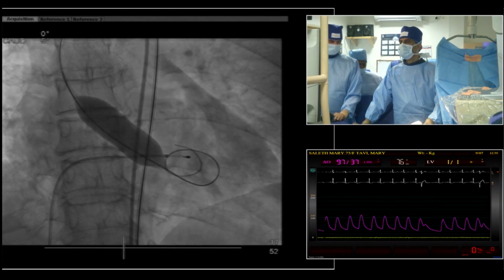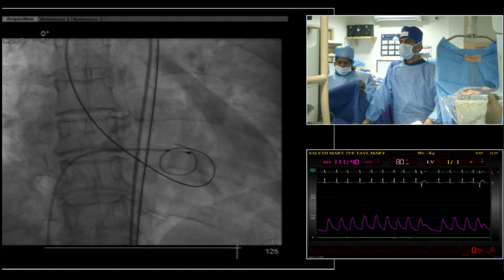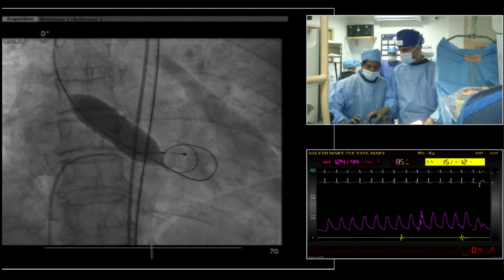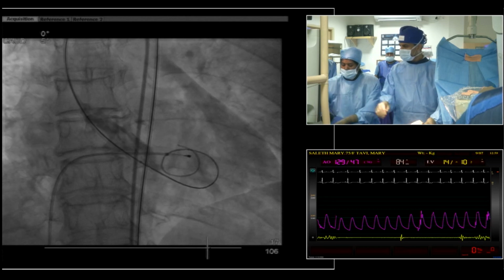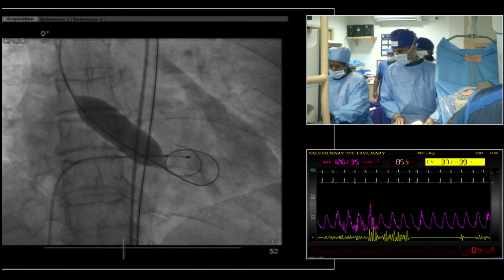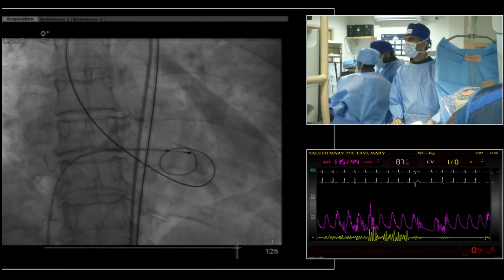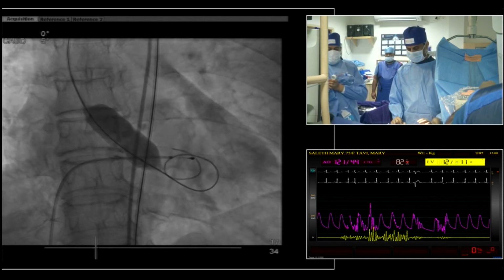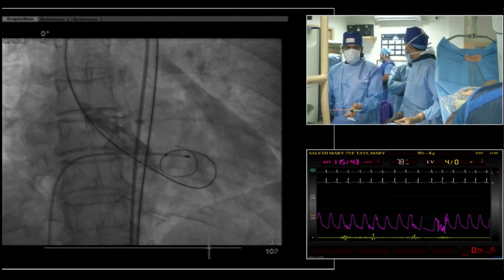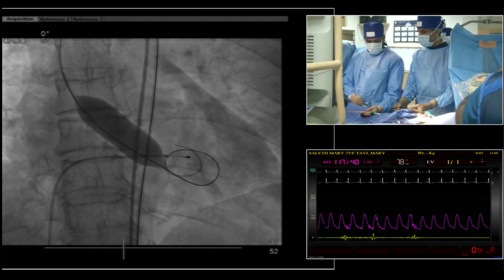I fully agree. For bicuspid valves, I think it's very important to measure the annulus and also the intercommissural distance. The shape could be like that, or like that. So according to this, you will select a different valve size. In this case, the annulus size is 22.7. The intercommissural distance is higher, around 27, 26. So in this case, the shape is just like that.